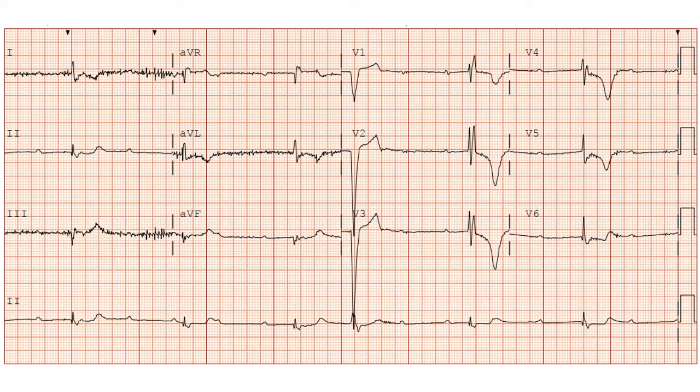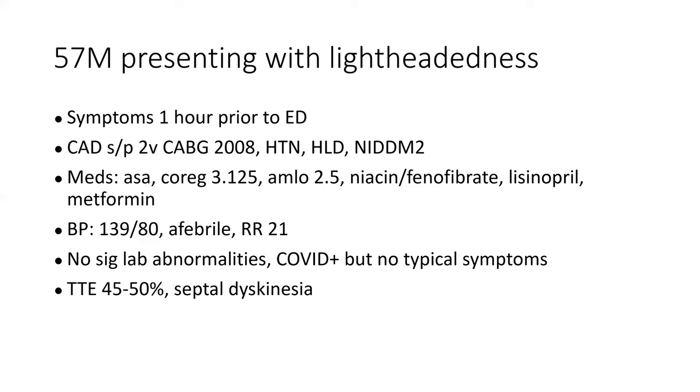What do you mean by advanced? I mean there is both alternating RBBB and LBBB, as well as complete heart block. Do you think there is conduction? No, sir. What I mean to say is this escape rhythm is coming once from the left ventricle and once from the right ventricle, I think. So this signifies a very unstable patient. He or she might develop complete arrest or bradycardia-induced VT/VF soon. So I'll consider this and do early temporary pacing or pacemaker.